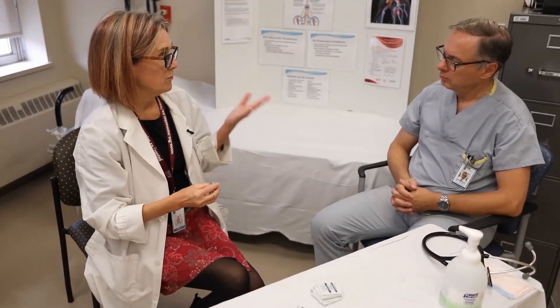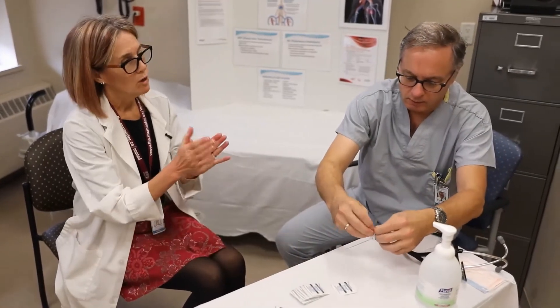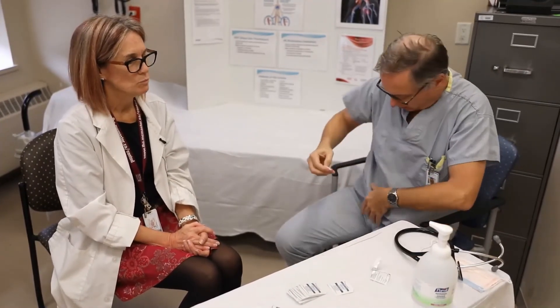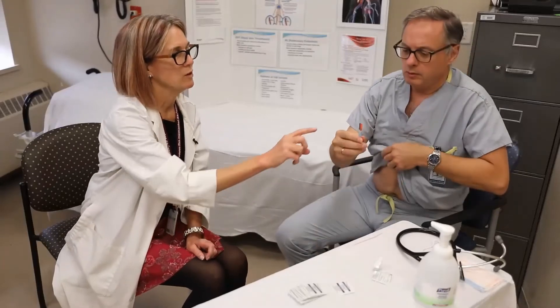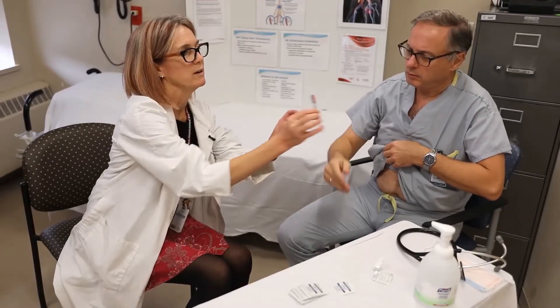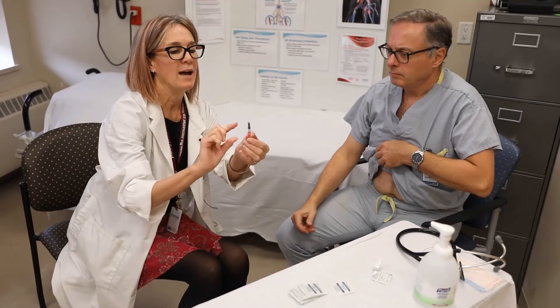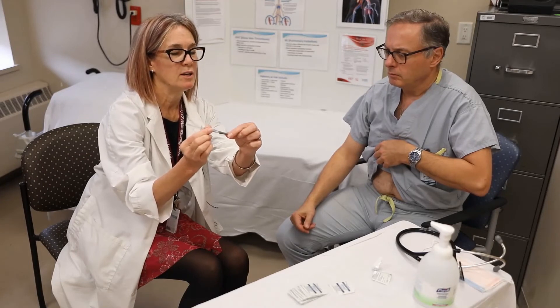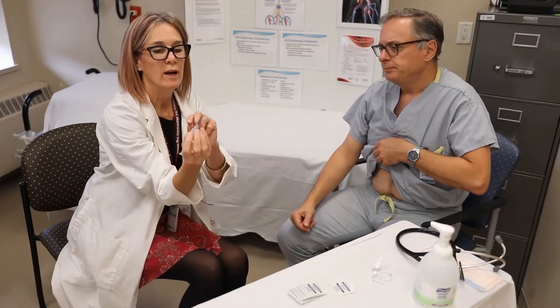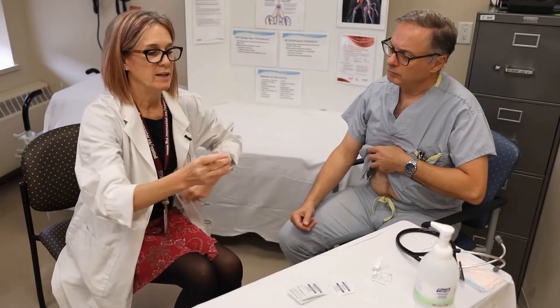Now I'd like you to try it yourself. You have a different type of syringe — it's got a safety measure called a needle guard. What we want to do with this type is hold the needle guard back and hold it by the barrel of the syringe. You're going to pull off the needle cap, which is a little bit sticky. This one also has an air bubble in it — don't worry, that will end up in the needle. Then pull the cap off and inject.